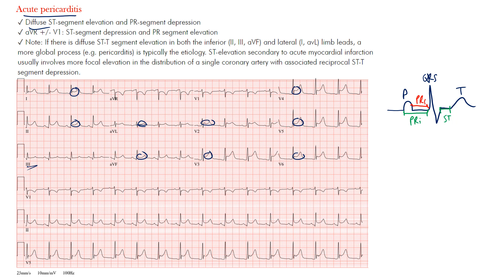What we often see in pericarditis is diffuse PR segment depression — the PR segment drops down and the ST segment goes up. You can see the elevated ST segment and the depressed PR segments here. You can also see this in lead two. It's diffuse, meaning it appears not only in a few leads but throughout the whole EKG, because the entire pericardium layer is inflamed.